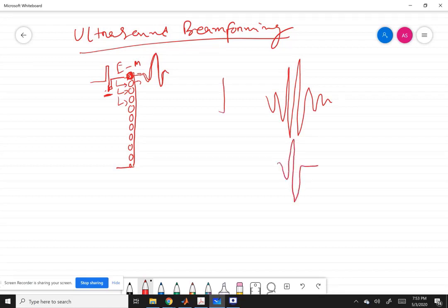Impulse means if I give the transducer a single sharp voltage input, then what is the output it gives? Suppose it's a single input transducer, and I give a very sharp single voltage strike to it at the input, then what is the output it gives? This is called the impulse response. The transducer which has a sharper impulse response will help us reconstruct very sharp images, versus transducers which have less sharp impulse responses.